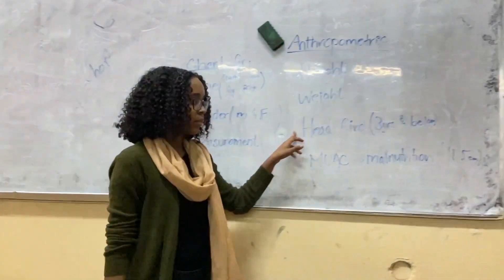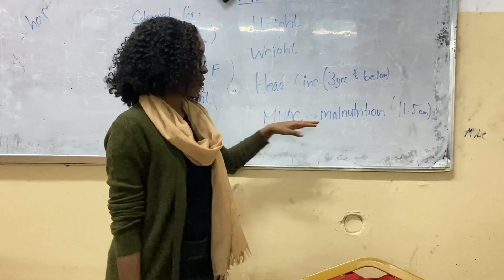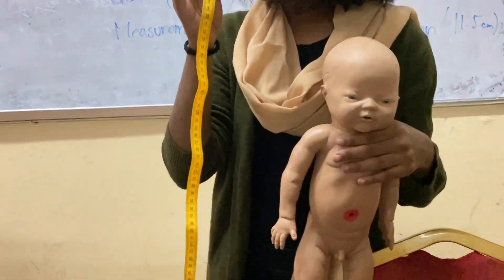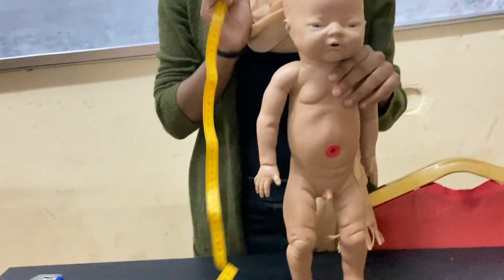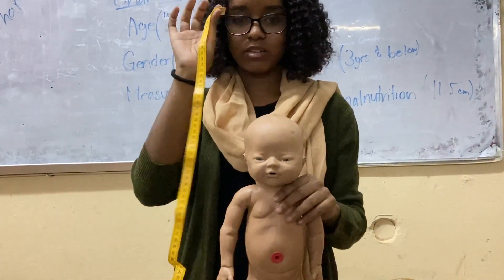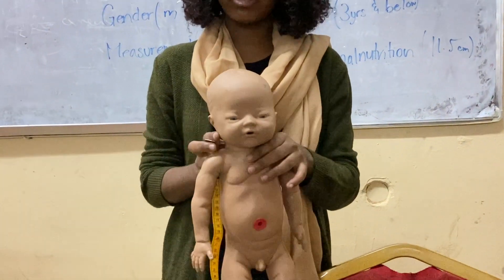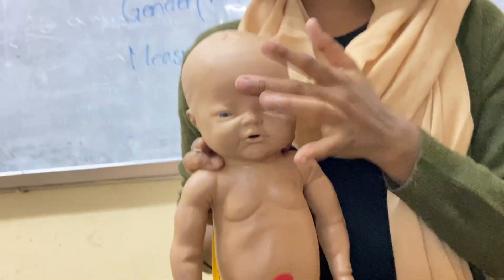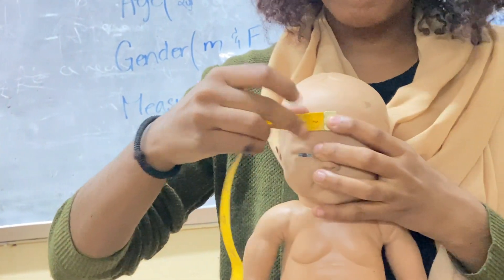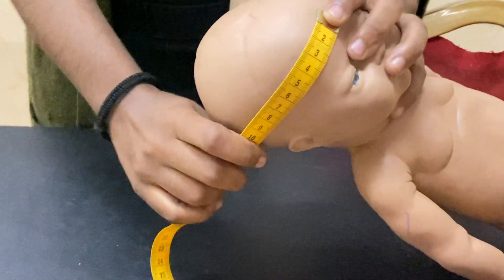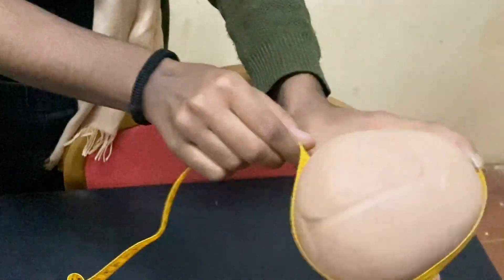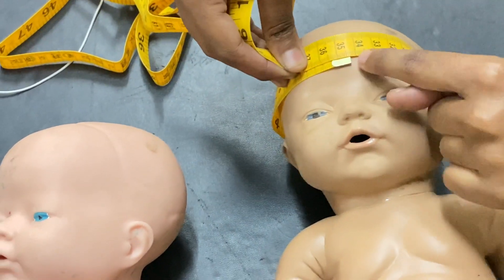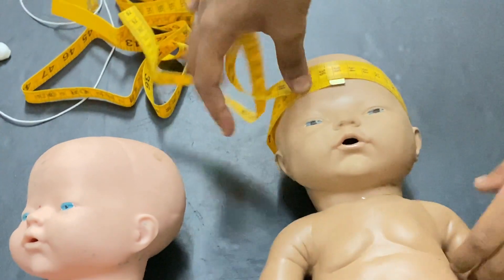Next, the head circumference and the mid-upper arm circumference, which we're going to measure for malnutrition risk. For the head circumference, we have the baby and the measuring tape. Make sure the tape is on the centimeter side. You have to measure it on the most prominent areas of the head — on the occipital protuberance and on the most prominent part of the forehead. Start by putting it on the forehead, go all the way past the occipital protuberance, come back, and measure it. You measure whichever part hits the metal — approximately 34.3 centimeters. Then you plot it on the chart.